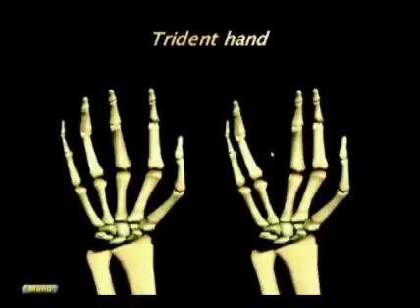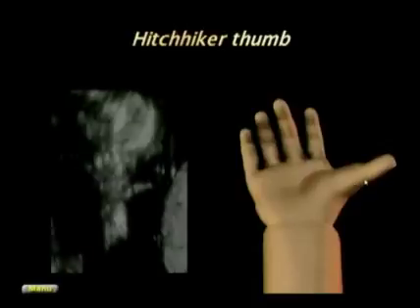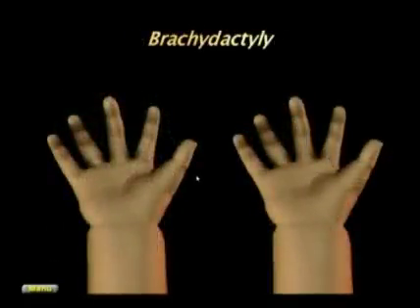A trident hand is a hand that has a gap between the third and the fourth finger, and that is quite characteristic of achondroplasia. And here you can see the gap between the third and the fourth finger. Now, many babies can do that. What is important is to make sure that this persists during the whole exam and is not just a very temporary finding. A hitchhiker thumb is a thumb that is maintained at 90 degrees to the hand, an uncomfortable position that a baby should not be able to keep for more than a few seconds.